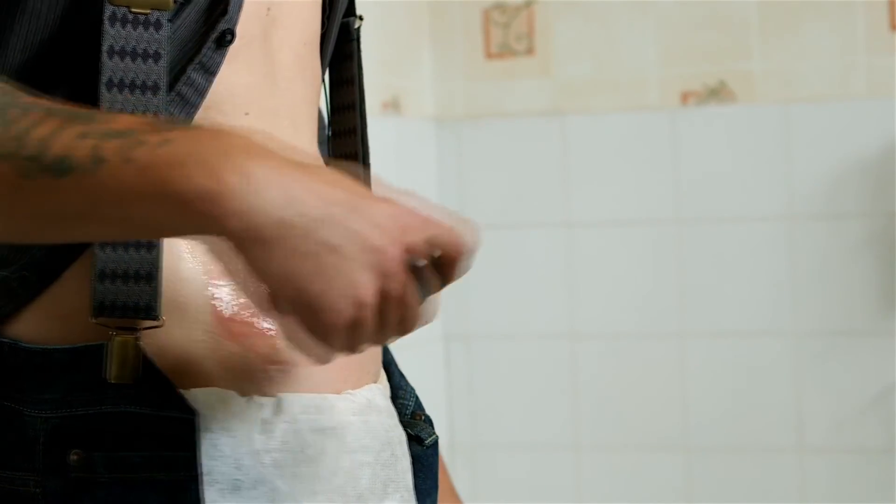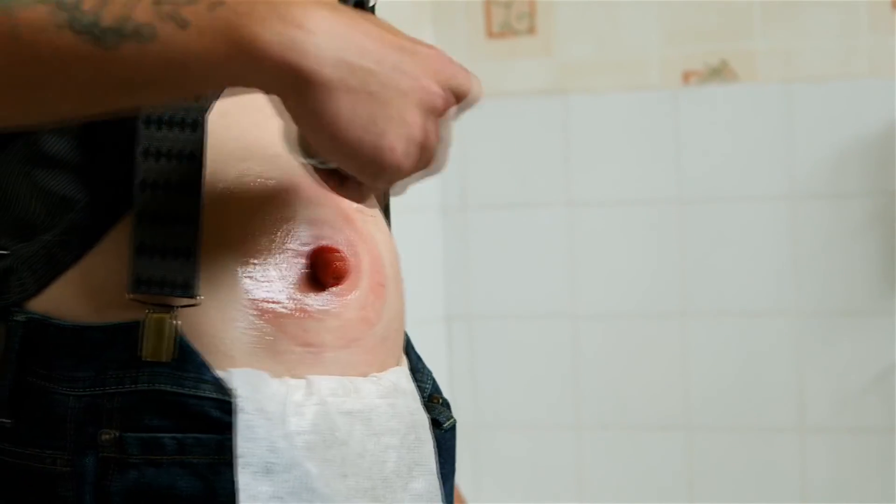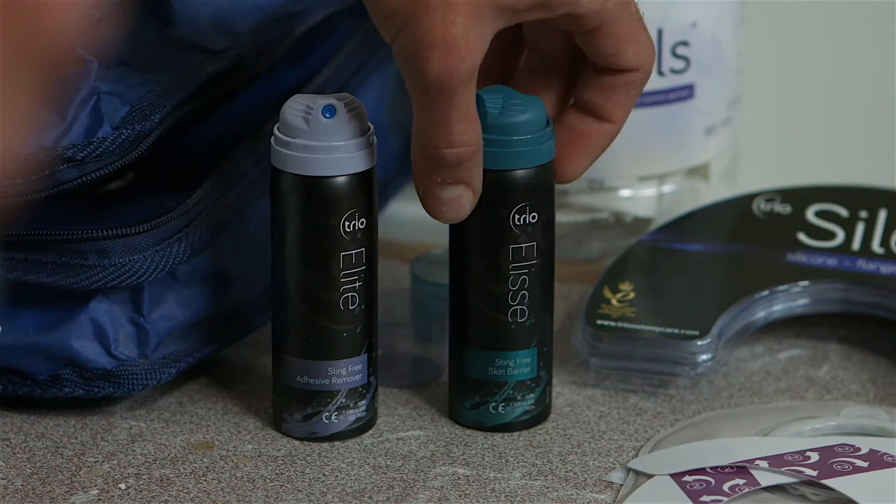I also use the Elite Spray-On Skin Barrier. It's fantastically easy to put on — you just spray it on. It dries in a matter of a few seconds without any problems. It helps the bag to adhere onto the skin and keeps the skin feeling clean and fresh.